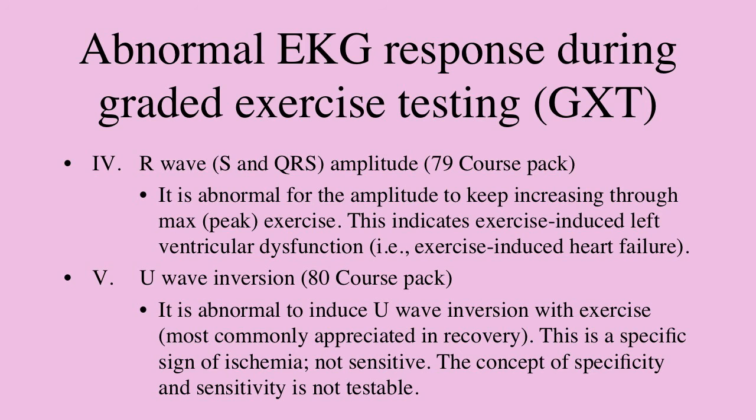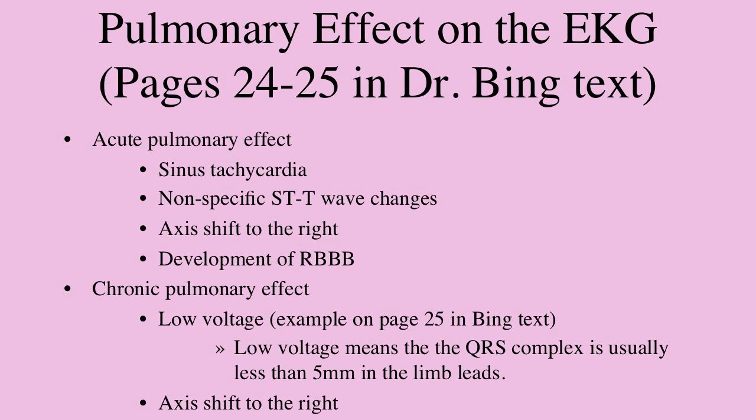We'll shift a little bit then, still under part 1 of module 4, to some additional information, and take a look at some other information in the course pack and also in the text. The first area is the pulmonary effect on the EKG.